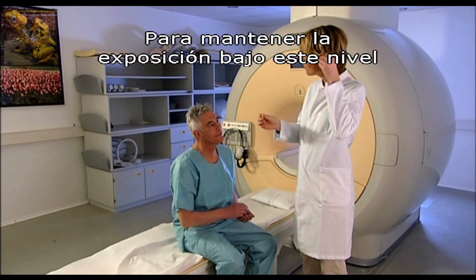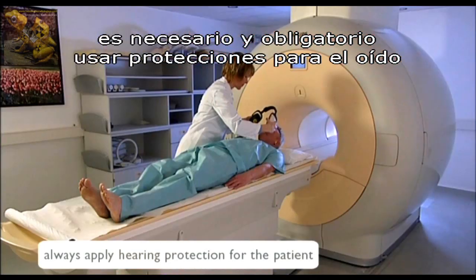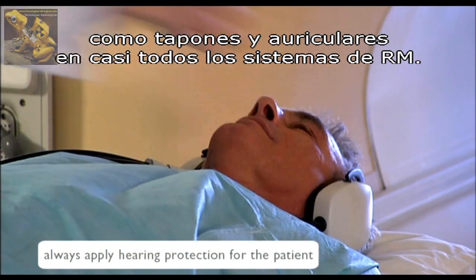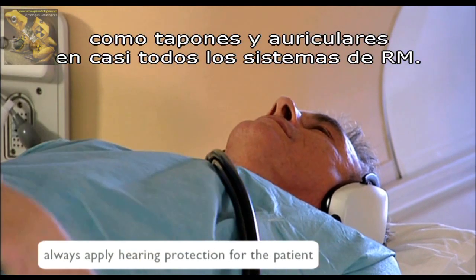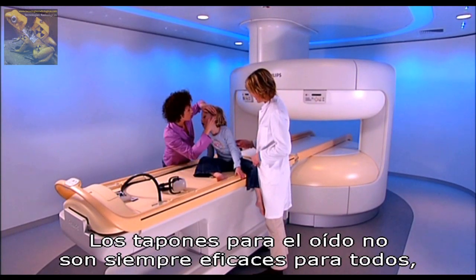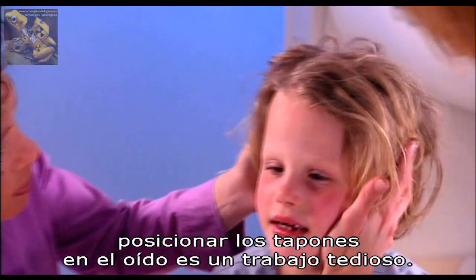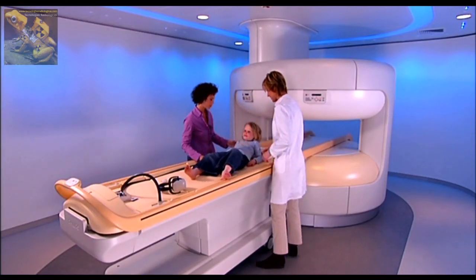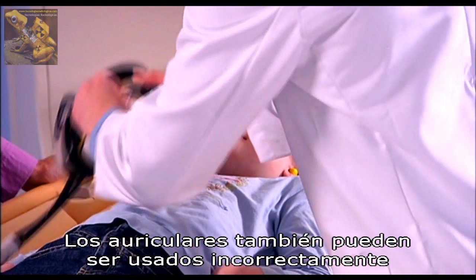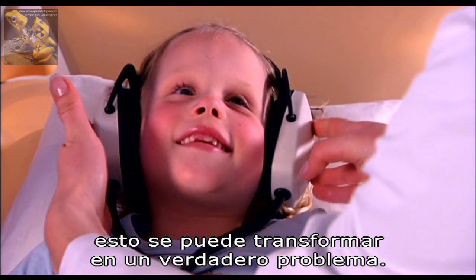To keep the exposure below this level, some hearing protection in the form of earplugs or a headset is necessary and obligatory for almost all MR systems. Earplugs are not always effective for all patients. Positioning of the plugs in the ear is a tedious job. Headsets can also be applied incorrectly, and in the case of children and babies, this can become a practical problem.